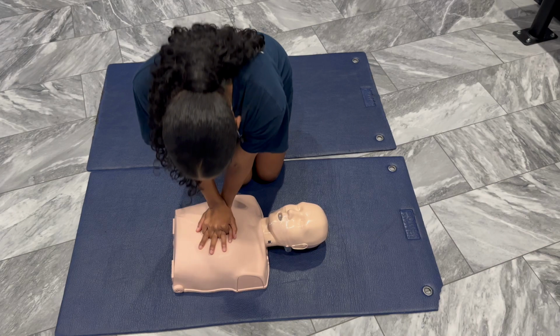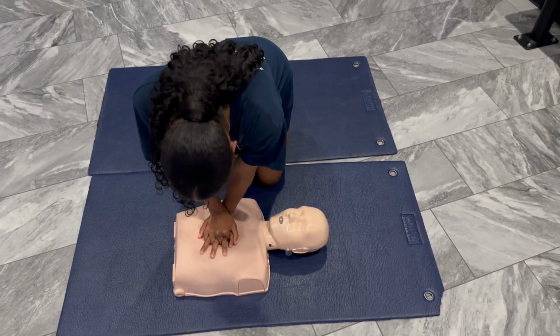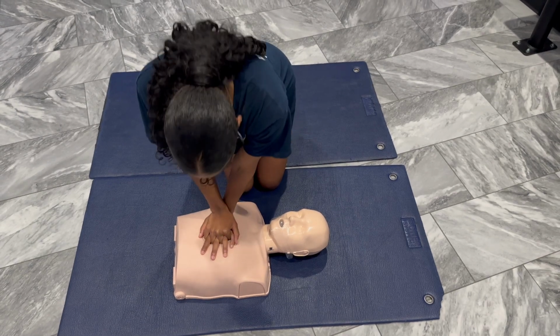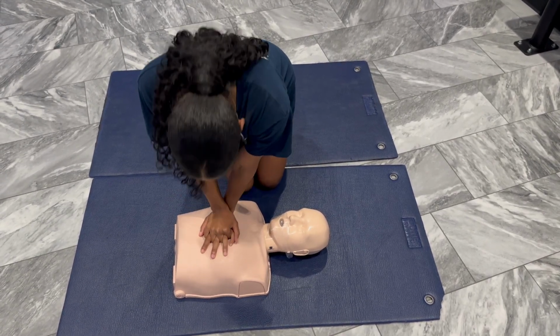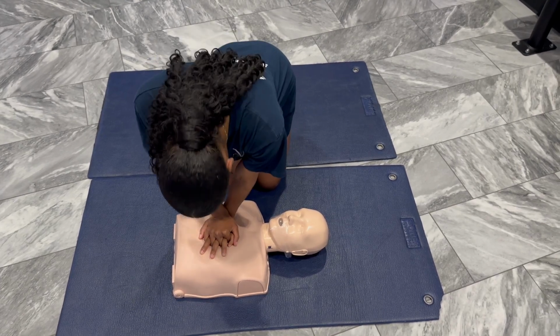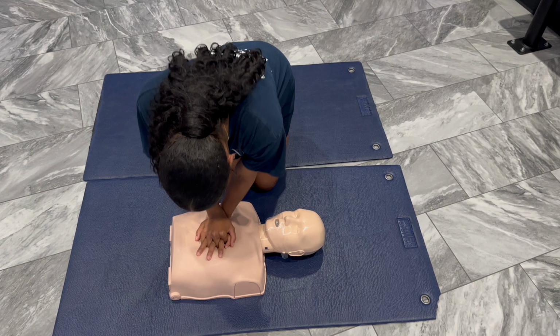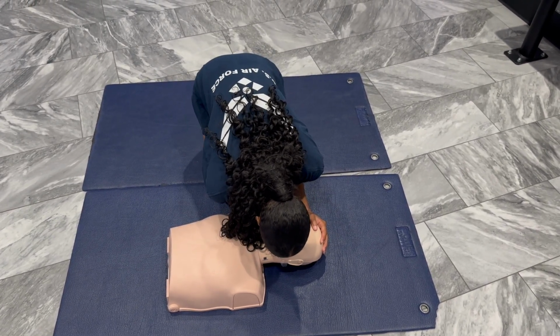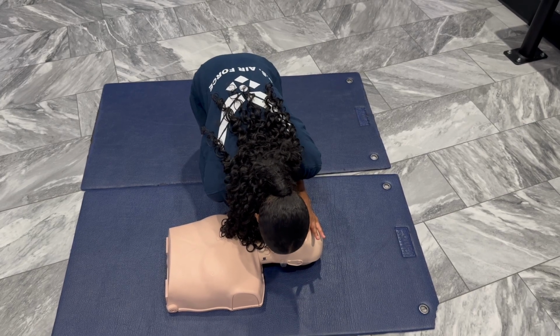Check for a pulse by placing 2 fingers on the carotid or radial artery. If the victim does not have a pulse, you will need to provide chest compressions. Remember the acronym CAB. C stands for compressions, A stands for airway, B stands for breathing. You want to provide compressions at a rate of 100 to 120 per minute.